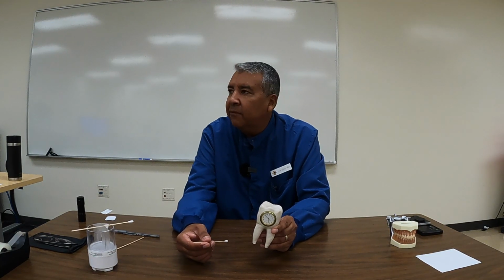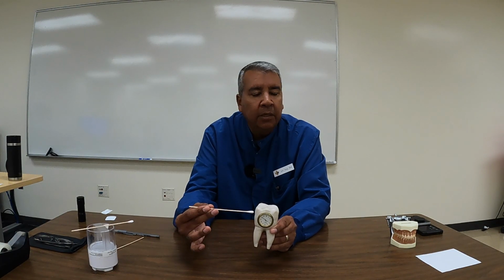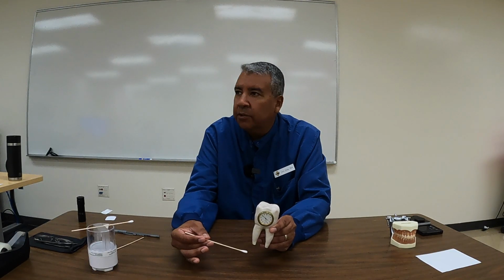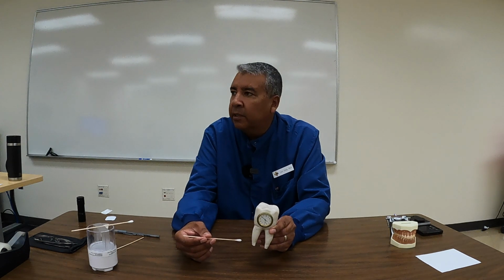When you bring him back the film, he is expecting to see, whether it's a molar or a premolar, the crown, the root, the apex, and the surrounding bone structure. If we are missing the apex, guess what? We didn't get what we needed, and we have to retake that x-ray.